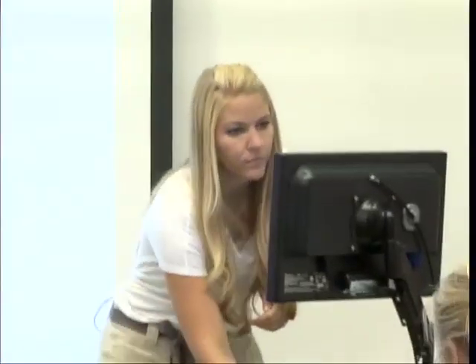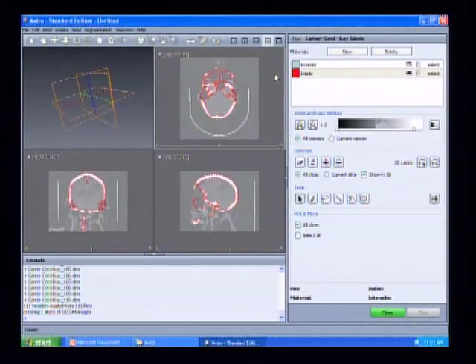So what I would recommend doing, because now it's really difficult to see in these three views, is if you're zoomed out enough where you have this background around your slice, you can click in the empty space in one of them. Say you click in the top right, which is that XY.